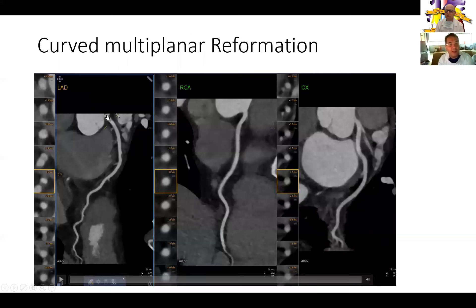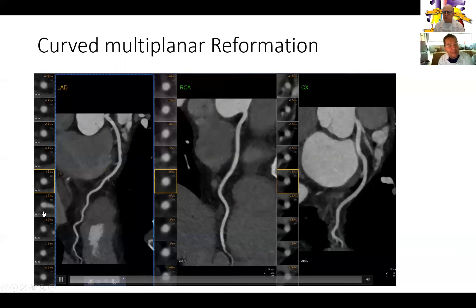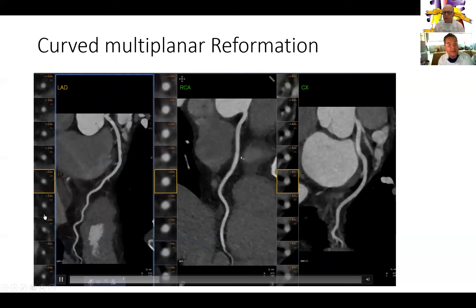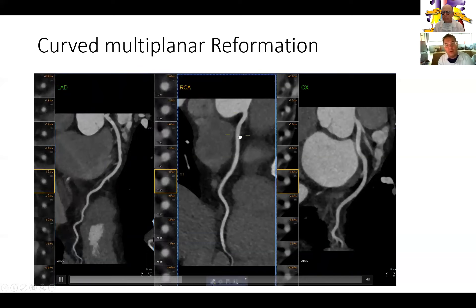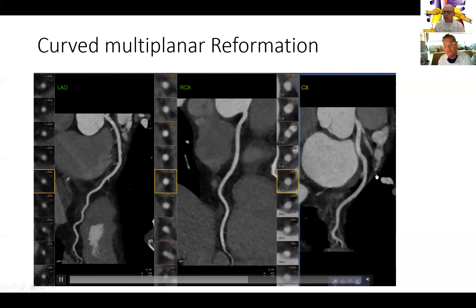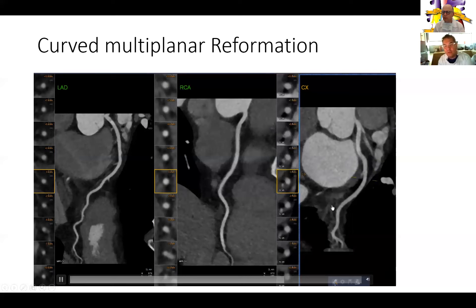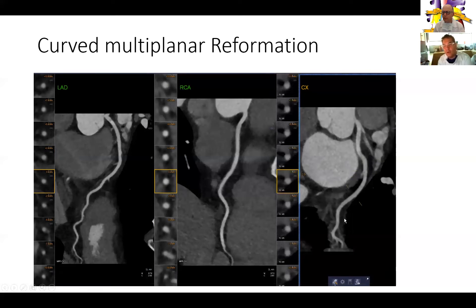Finally, there is a format done automatically by the machine: the machine detects the central line of the vessel — here on the LAD — and displays different short-axis views throughout the length of the LAD mid-segment and distal segment. These short-axis views are useful to see the morphology of the plaque and the vessel wall. The same technique is applied to the RCA, displaying multiple short axes from base to apex, and then to the circumflex artery, going down through the circumflex. You can look at the bifurcation of the OM and then go all the way to the distal branches.